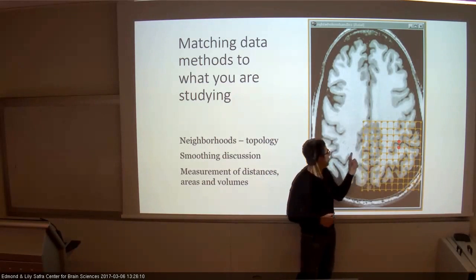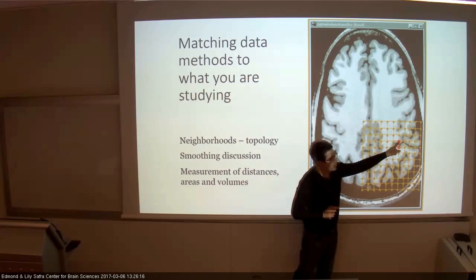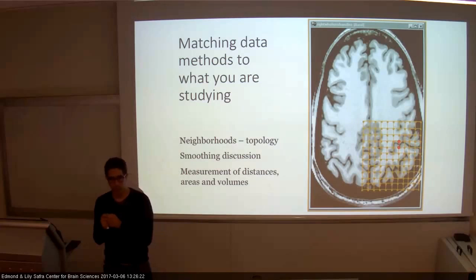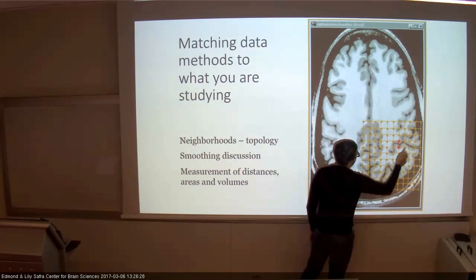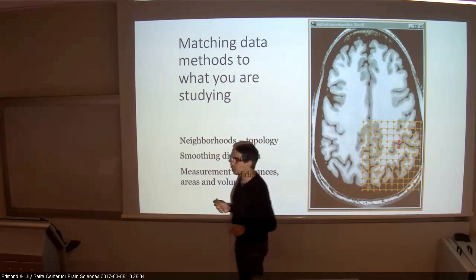So the intensities in here come from different voxels. So it could be that these two points, which are very close in image space, could be very far in brain space or in cortical space. Do you see that? Was that clear? They are really far. They might be centimeters apart, but in image space they might be millimeters apart.